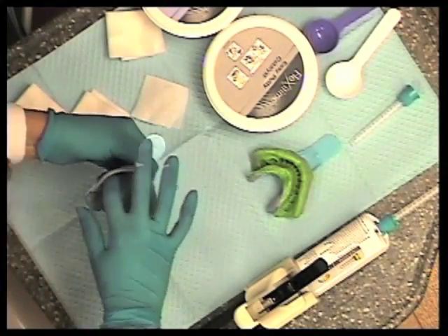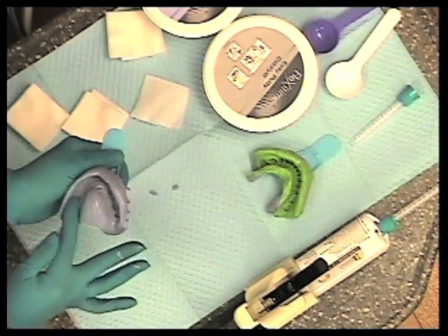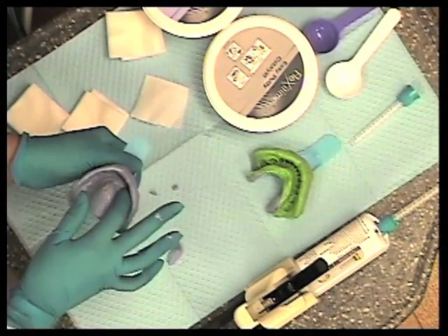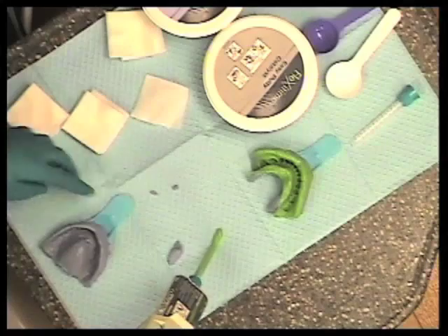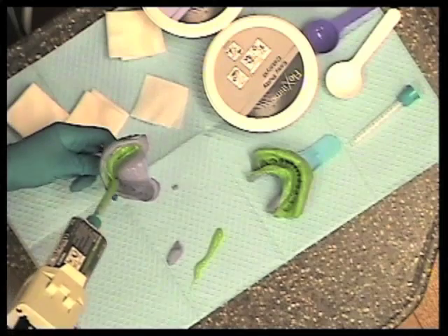She will create a little sluice way for the wash of the polyvinyl material. She pinches any area that she wants to extend a little further, maybe peels off area that's extending back too far. Patients appreciate that in the back of the throat. And then she can pick up her wash of polyvinyl. And again, just put it where the teeth are.